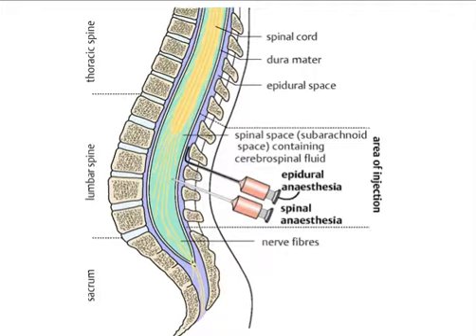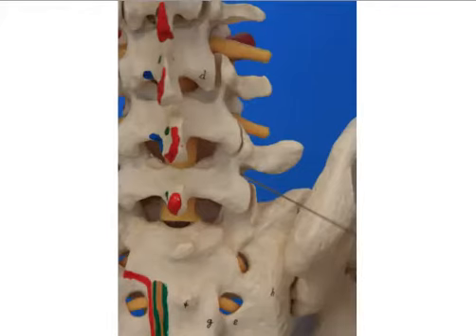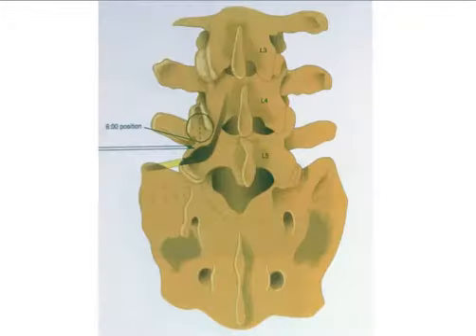Here's what an epidural, the anesthesia epidurals, look like. This is the intrathecal procedure. This is where we're going. We're aiming more for the facet joints when we're doing your treatments. The facet joint, watch the live video trainings. You'll see me drawing a line.